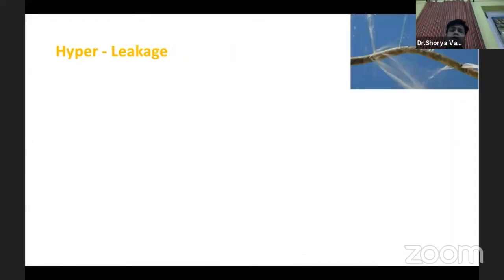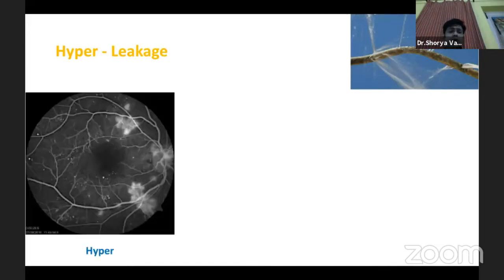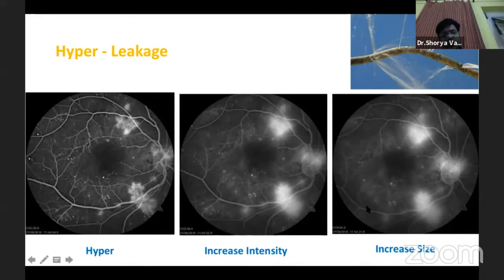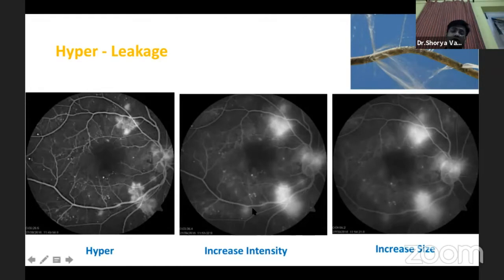The next type of hyperfluorescence is leakage. Like a leaking pipe, there is a hyperfluorescent lesion seen in the early venous phase that tends to increase in both intensity and size as you progress into the late venous phase and more so in the recirculation phase. These are most typically seen in neovascularization of the retina and neovascularization of the disc.